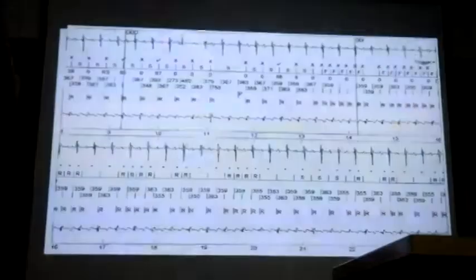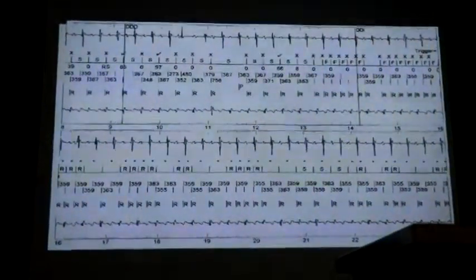and all the while we were measuring the R wave, measure R wave, measure R wave. As his heart rate came up, his R wave was doing this. At about 160, it hit the point at which it started to pick up his T waves. So, what do you do? You could go in and reposition that lead. No, exactly. This is an 18-year-old. So we decided in this patient to go up with the VT detection.